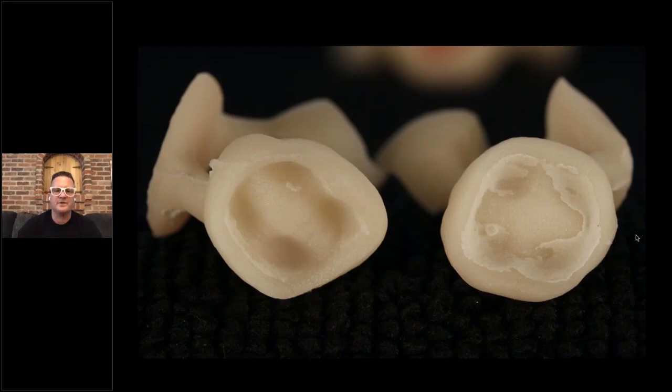This was another picture that I took. I used the SR liquid on the left, and on the right, I didn't use any. And there was still not a lot of reaction layer. You all know on the inside, on the intaglio surface, there's more reaction layer. But I was just like, what? This was the very first pressings. I thought, for sure, we're probably going to mispress some. But I followed the instructions and that's what we were getting.